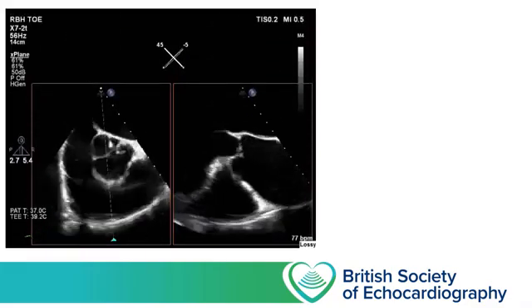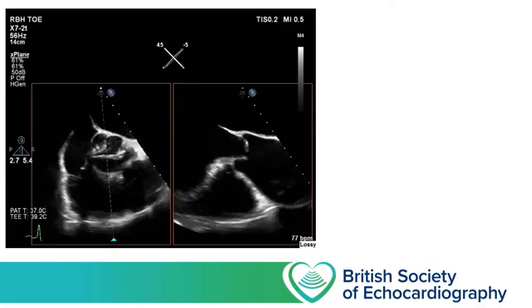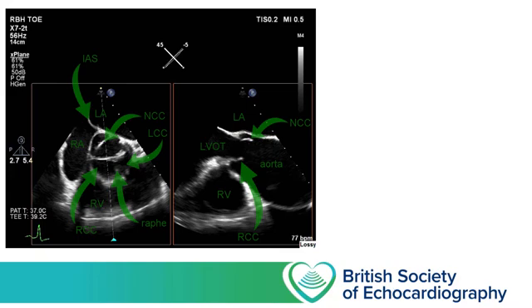This next clip is from an intraoperative TOE, demonstrating a bicuspid aortic valve. Here we have 2 sets of images, set 90 degrees apart, which are analogous to the parasternal short axis and parasternal long axis views that we obtained during TTE.